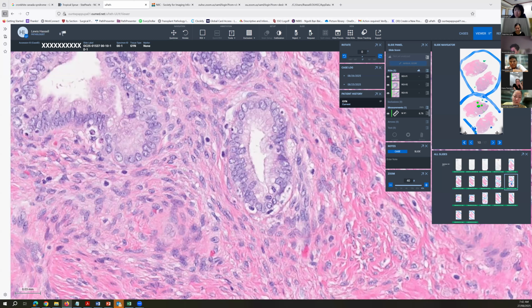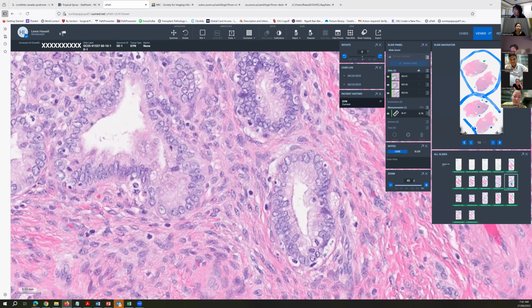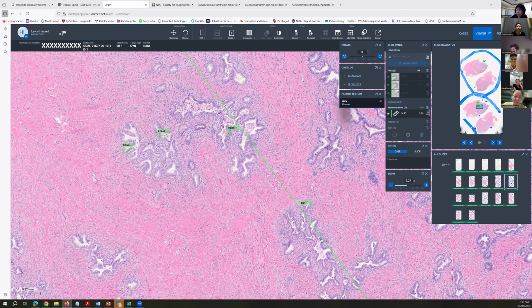And I don't know if Esther or Mini would want to agree with me on that, but I haven't seen it very often. This looked like a fairly good example to me of that kind of change, particularly when we had the other areas that showed a much more characteristic, typical endocervical adenocarcinoma pattern. So that's my first question I would ask my colleagues here. Have you ever seen these two patterns in the same patient, in the same lesion?